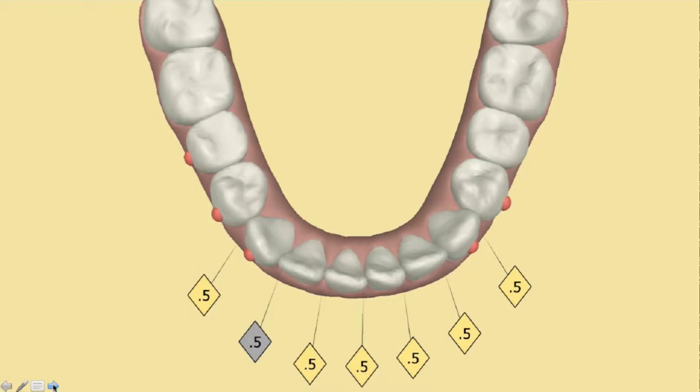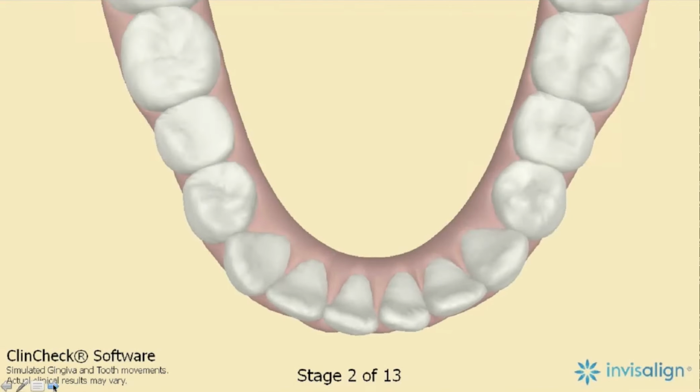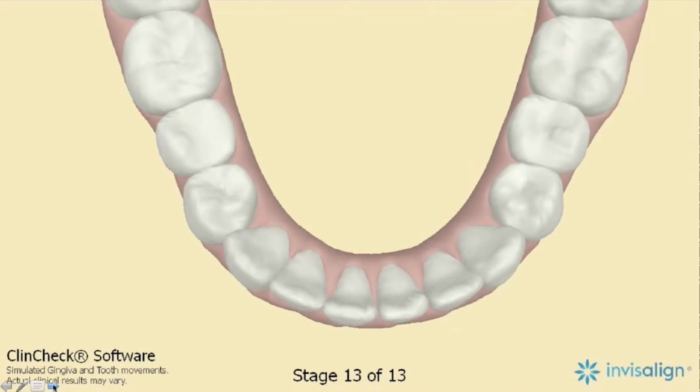She came to me for refinement, and what I did was I pushed the teeth back out, derotated them, and then brought them back in like this. I brought them out, rotated them, and then squeezed them back in. So you can't very well derotate a crooked tooth when all the neighbors are tightly squeezed against it. So I'm going to give you some good examples of understanding the crest and some bad examples.